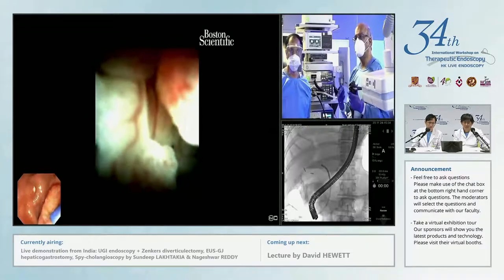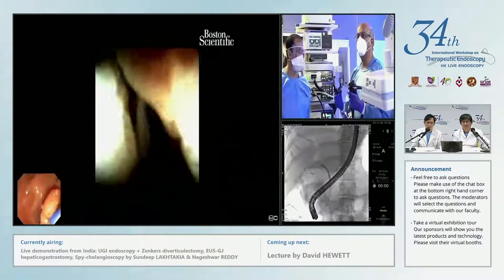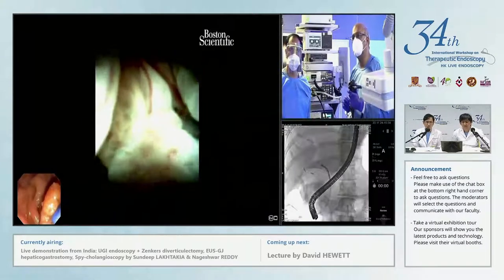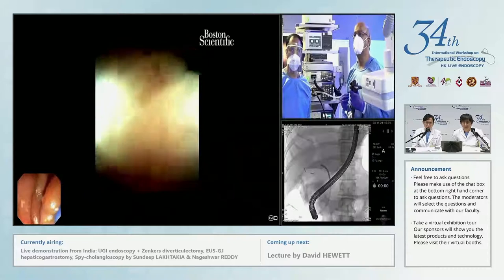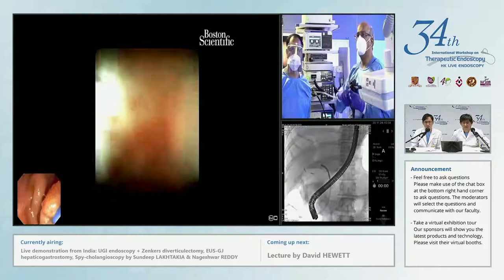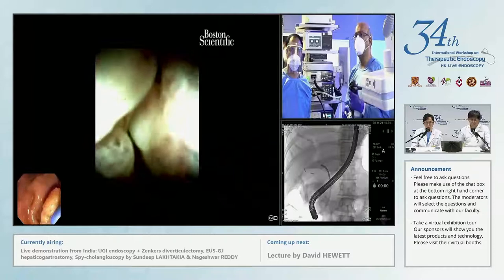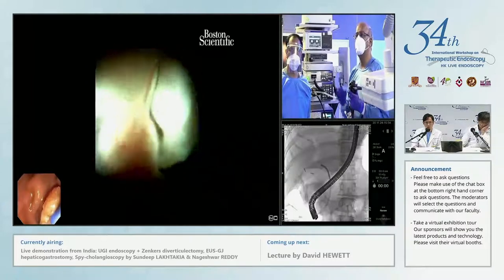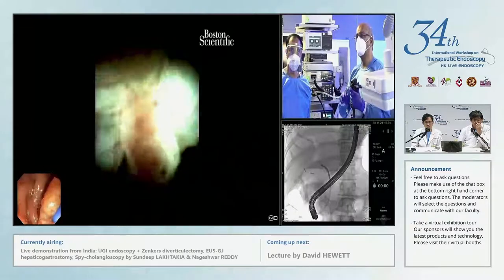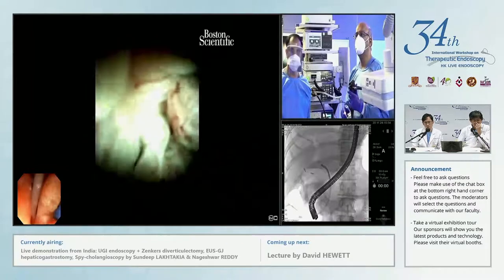When you take pathologies, you can find whether it's pancreatic or biliary, gastric, or the oncocytic type. That will give the prognosis. But what we can clearly say from this picture is that you're dealing with the intraductal papillary neoplasm of the bile ducts. That is the recent WHO classification, IPNB. And these tumors do well with surgery. The variations of these tumors are papillomatous tumors, villous adenoma, so many other names, but this is very clear now, the recent WHO naming. If there were a lot of mucus, I would have called it a mucin secreting tumor, but we don't see much mucus here. Right. I just see these very beautiful villi here.